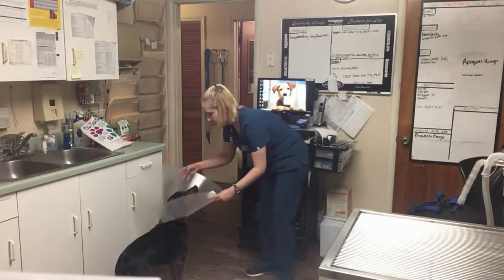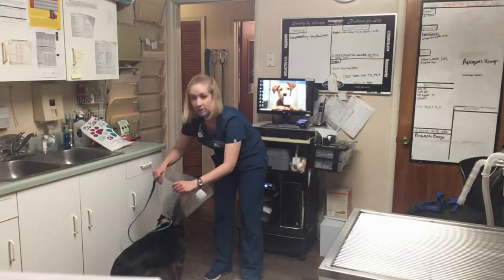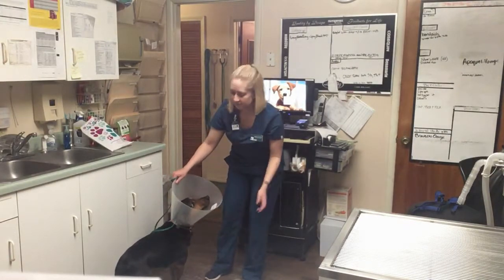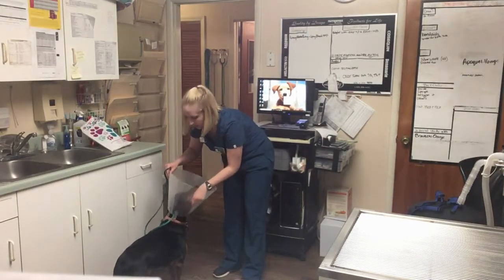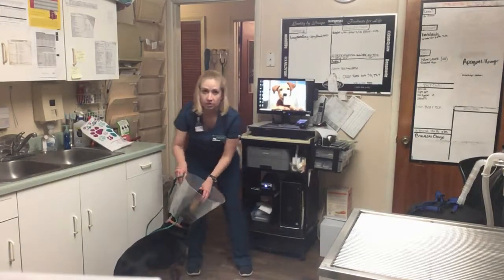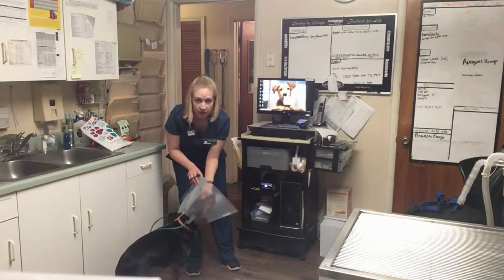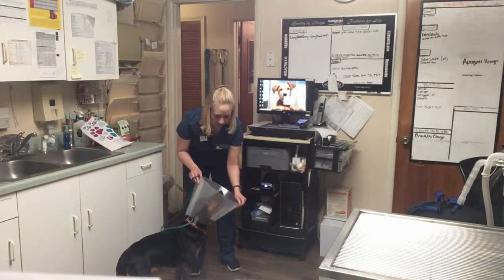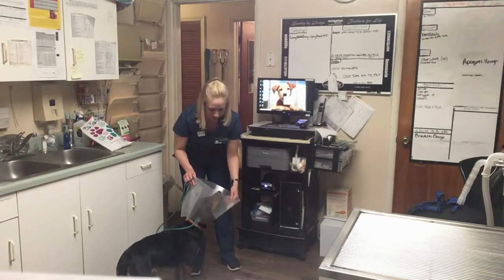So you're just going to want to test it and wrap it around. For this one, you have a couple of different options for sizes, and you do want to make sure that it will fit with one that probably won't slip over his head when you do set it, and then you can already tell that it does go past his nose. He does have a little bit of a longer nose, so you do want to make sure that it still fits past it. That will be the most important part, for it to fit past his nose.